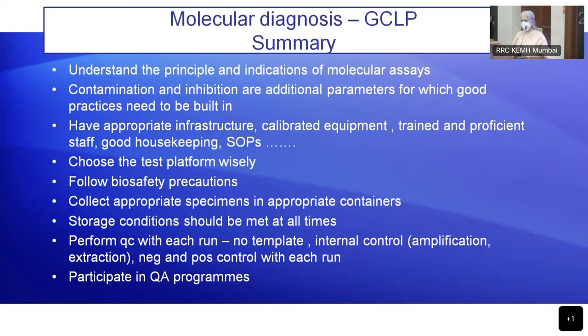Right? The next one, for the biosafety people, I think Dr. Sriya and Dr. Amir both did an excellent job yesterday, so let's not go into this. The next one, please. Take appropriate specimens in appropriate containers. So, can you give me examples of two containers that should not be used? Heparin should not be used. Very good. The other one? Starts with F. So, it's not that you cannot do a PCR from formalin, but the chances of getting a positive are much lower, with the fixation being on the dark side.